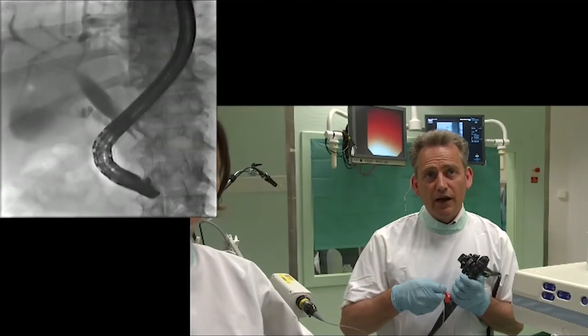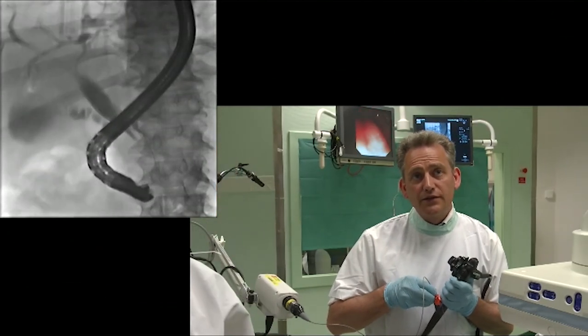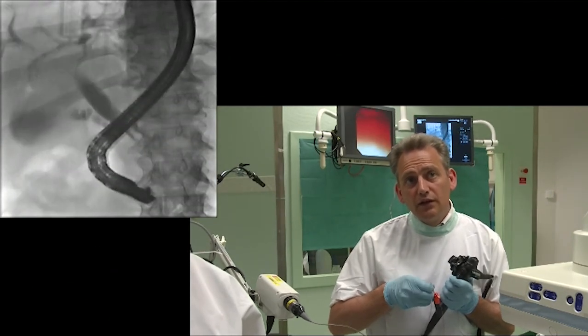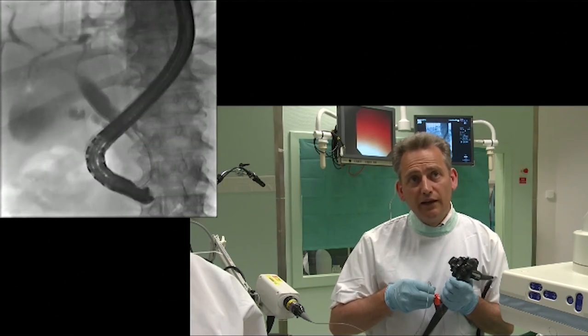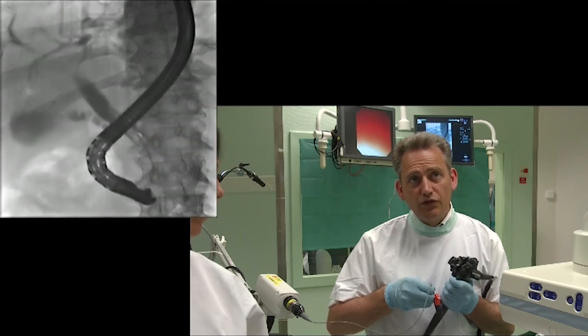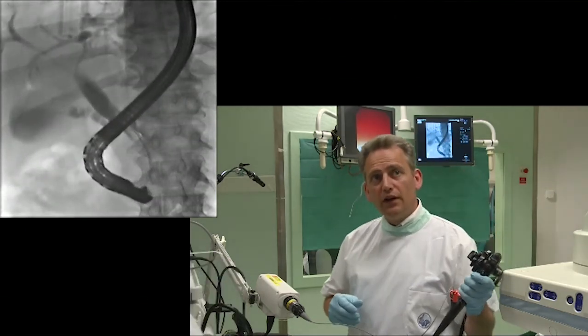And we will now introduce the catheter under fluoroscopic guidance. There you can see now the catheter slowly going into the common bile duct without any kinking. We will pass the stricture and we will start the investigation well above the stricture also to see the normal common bile duct and the normal common bile duct wall. So this is now the intraductal portion of the common bile duct. So where this looks like a mass lesion in the pancreatic head, we slowly withdraw and we will remove the intraductal ultrasound catheter.